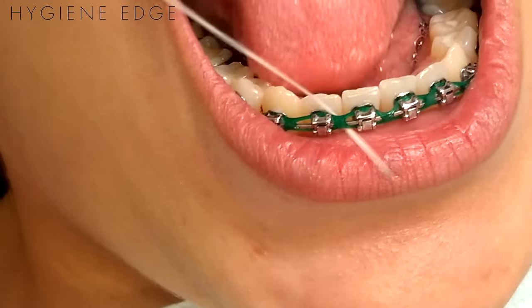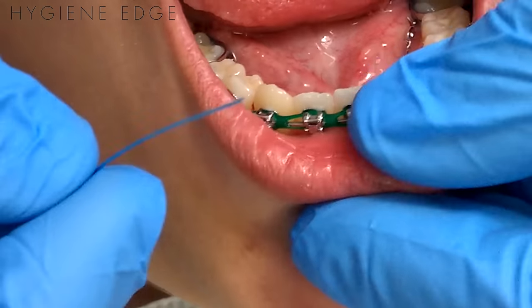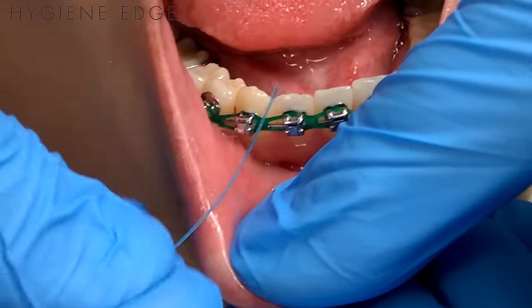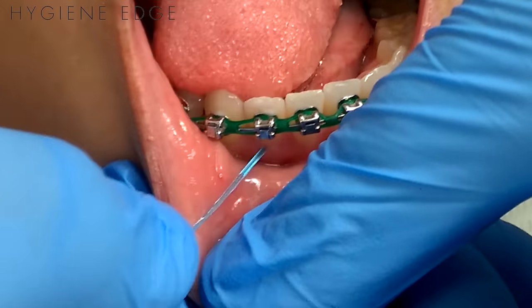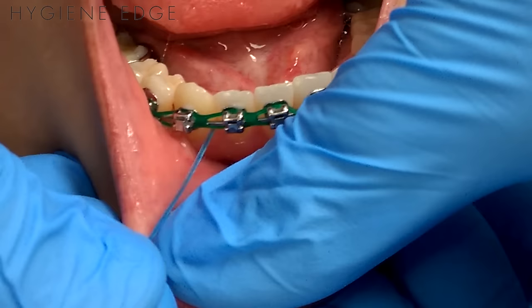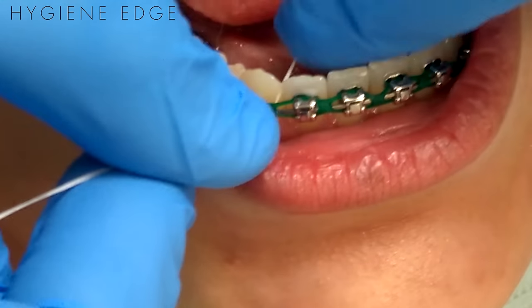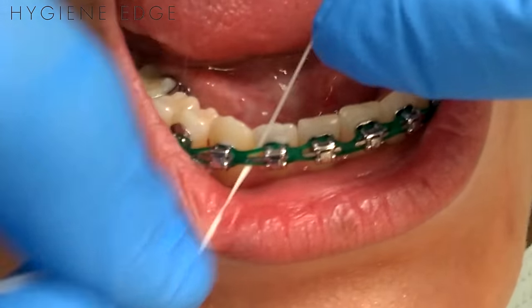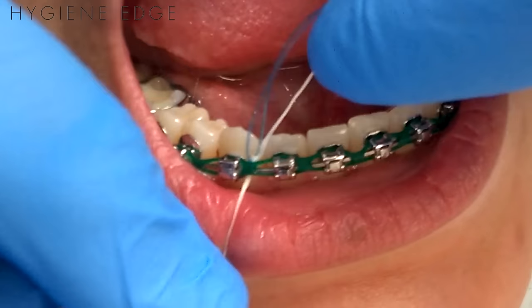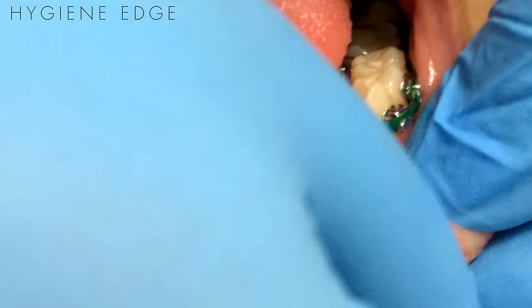The hardest part with flossing ortho is if the patient has a lot of inflammation underneath the brackets. At that point I always use my cotton tip to help grab the floss threader to get around that inflamed gingiva, and then you just do the best you can. Sometimes there's so much swelling that you can't even get your floss threader through, so hopefully your scaling has disrupted the biofilm enough that it'll start to heal.